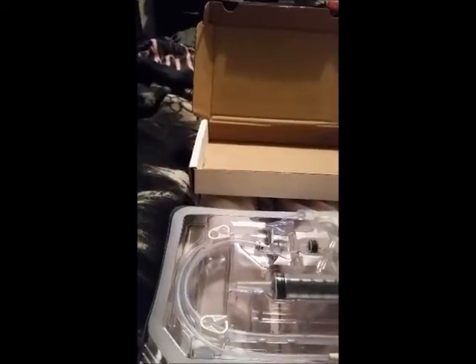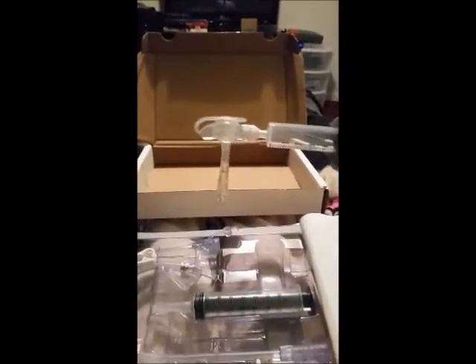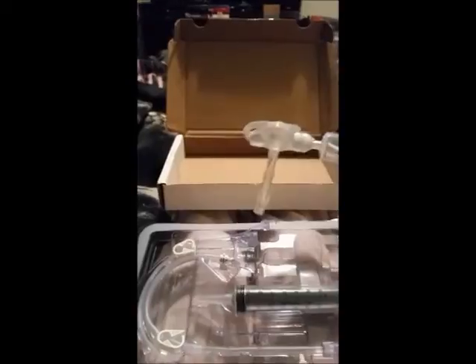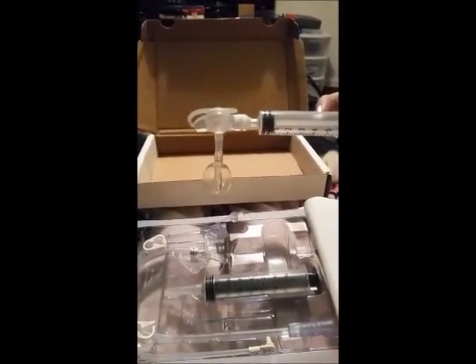So give me a second, and I'm going to set up my stand here so I can show you how we check to make sure this button's okay. Okay, so I couldn't set up my stand, so I'm just going to wing this. So I moved this syringe down to 5 milliliters, which is what this balloon holds. And what we're going to do is just press air into it, and see the little balloon inflates.